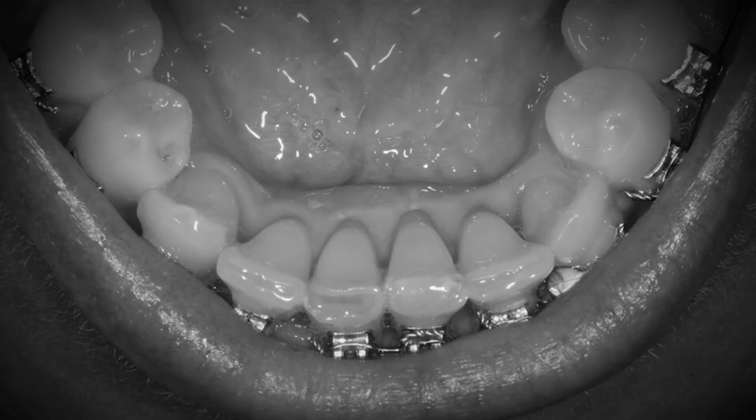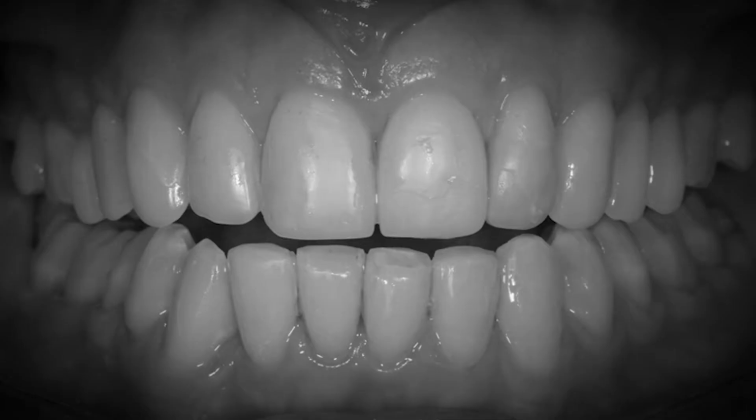And this lasted for a good 7.5 to 8.5 years. And with time, the patient felt that she would like to correct the lower teeth, the lower crowding. She was happy with the existing upper veneers. We could, in an ideal situation, remove the upper veneers and do the orthodontics, and then go back in and place new veneers. But the patient said, look, I'm really happy with the upper arch. Can we just align and level the lower teeth to fit within the upper arch? Which we could. As you can see in the next few slides, this is how we leveled the lower arch using orthodontics.